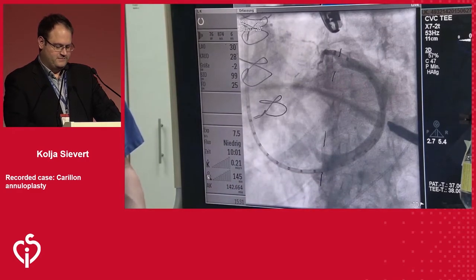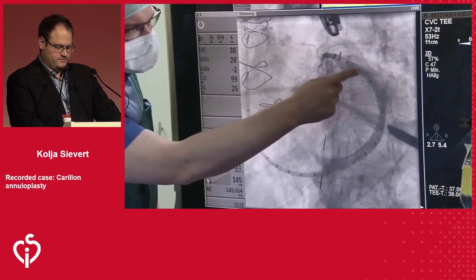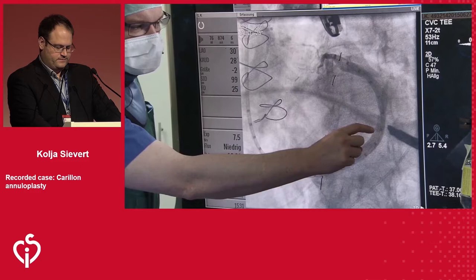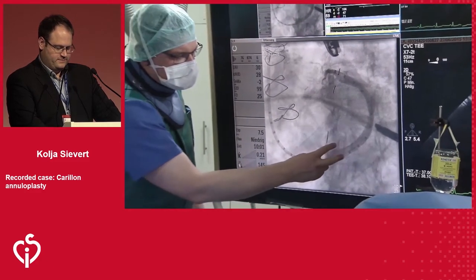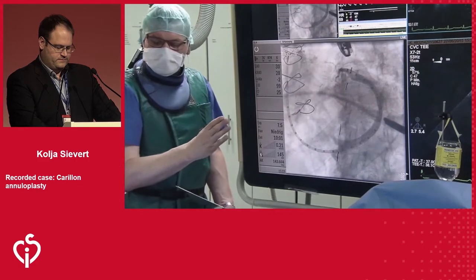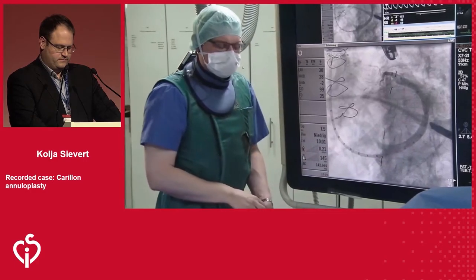And the device itself is only 6 centimeters long. So it will start here, and with no tension, will go 6 centimeters. So 1, 2, 3, 4, 5, 6. So the proximal anchor will be sheathed inside the delivery system right here, and then we'll pull tension, plicating the tissue, and deploy the proximal anchor. And then between the distal anchor and the new proximal anchor location, that's where the tissue will be plicated, placing a force between them, as well as a radial force inward.